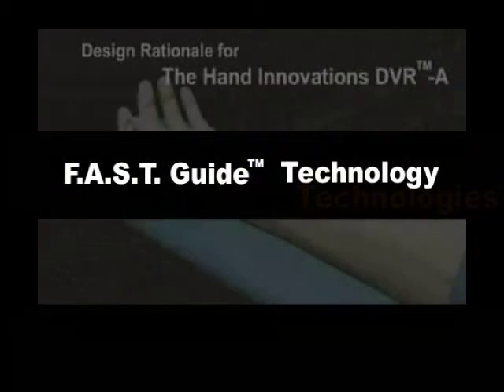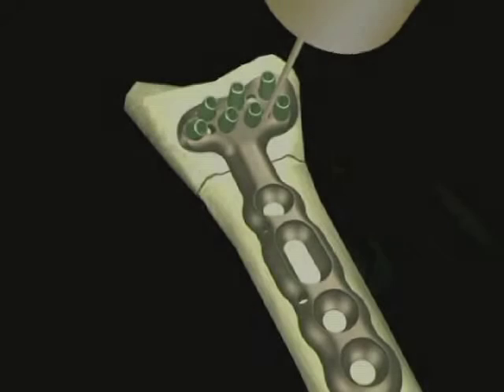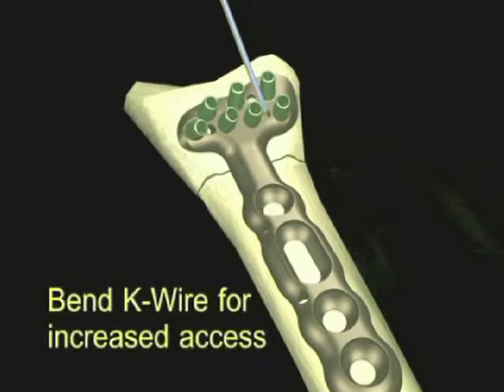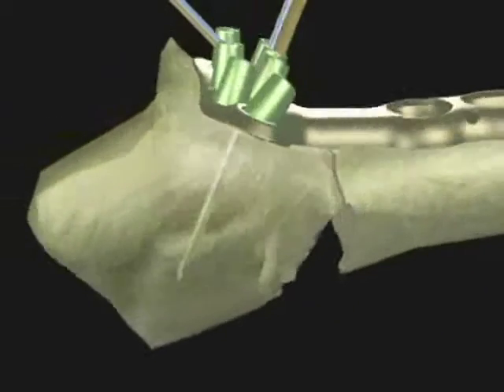The DVR anatomic incorporates preloaded single-use drill guides that are calibrated to the optimal angles, allowing you to accurately place all the pegs and screws without obstructing your view of the fracture site. Apply the plate to the volar surface of the radius and position distally to align the plate to the watershed line. Insert a K-wire into the hole on the ulnar side on the proximal peg row and bend it out of the way to facilitate drilling.